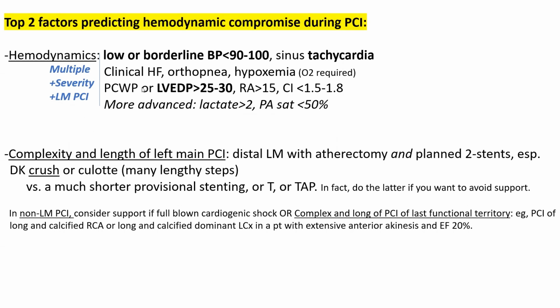And I also account, when only one of those is present, I account for the 6 additional features that I will describe. But very importantly, those 2 factors are not static, and that's a key idea. It's not that I see bad hemodynamics, I say, okay, we do need to use LV support. No, I keep in mind that both those factors are modifiable.